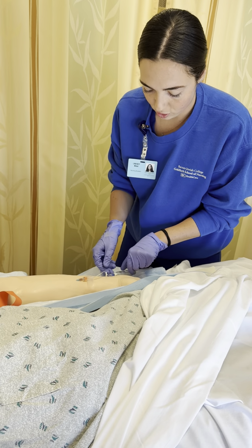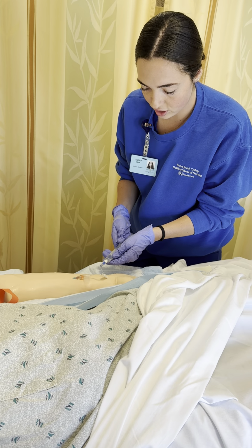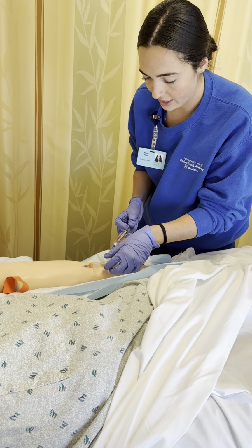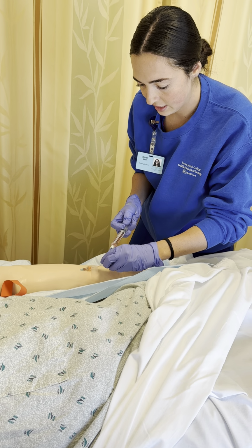Okay, so now we're going to aspirate. So I'm going to pull back. Looks great. And I'm going to flush the area.